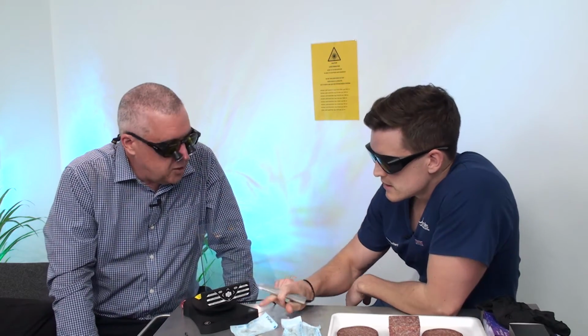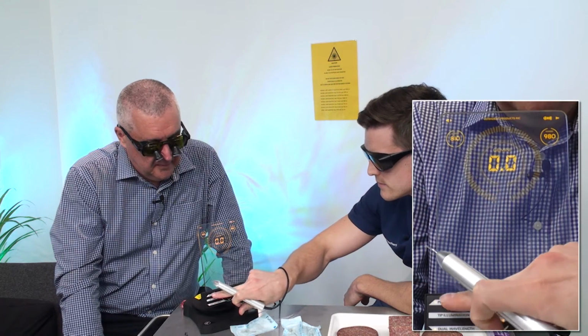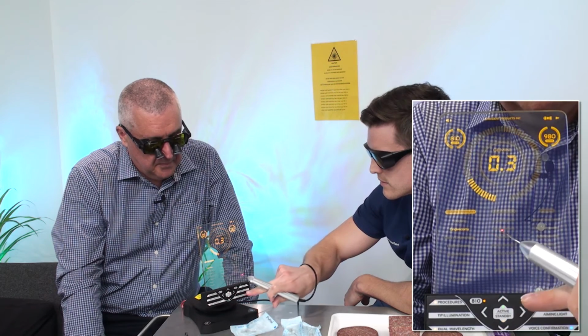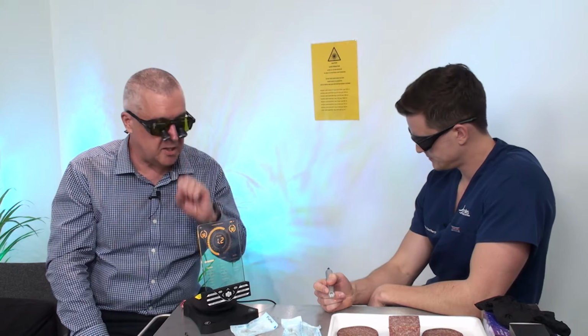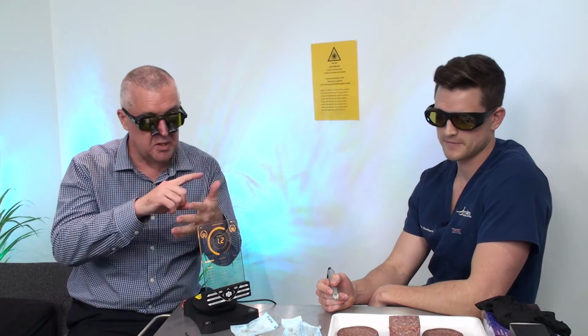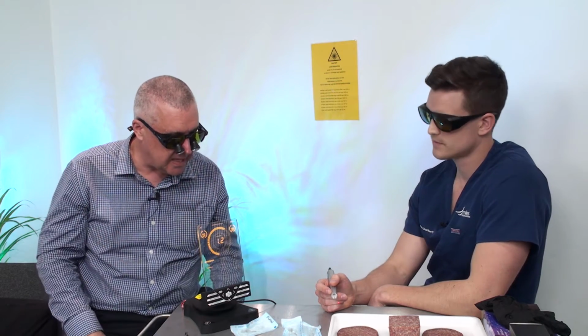So we might get you to select a pretty typical gingivectomy setting for us. Wavelength, standby. General dentistry. Gingivectomy, active. So you notice that the laser is talking back to us, which is just really reflecting the settings that we're going to be able to do. We're going to use some blocks of salami because it contains the major absorbers of water, pigment and blood that we obviously have in the mouth.